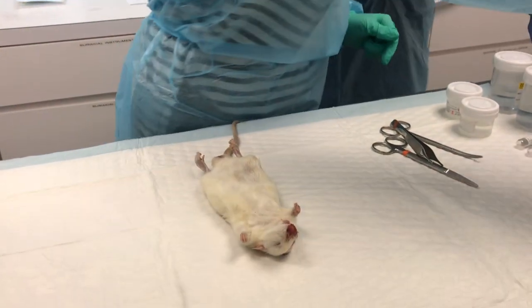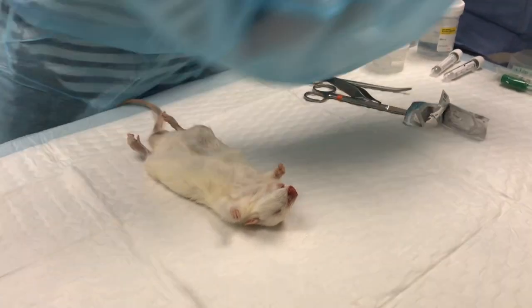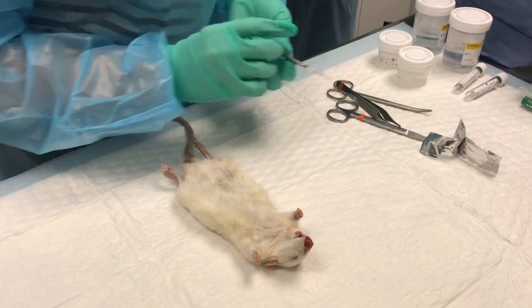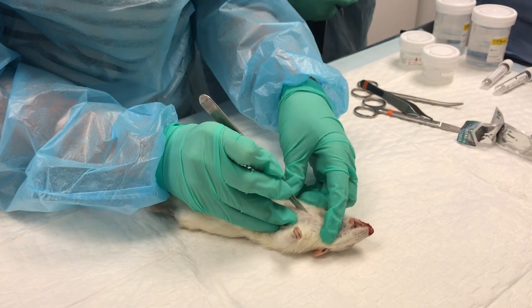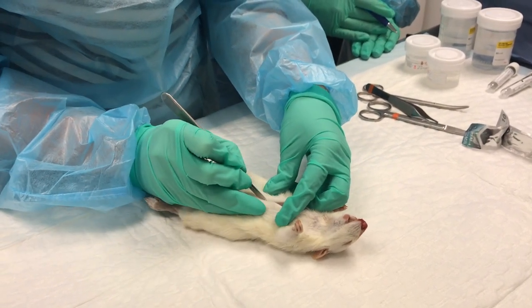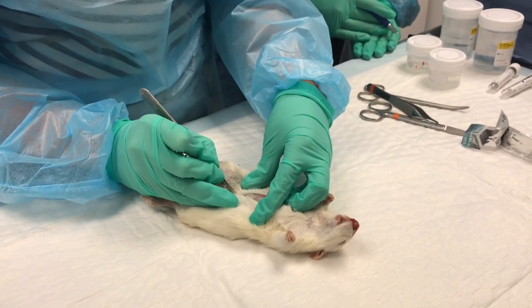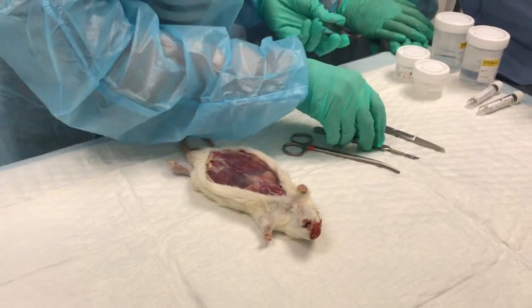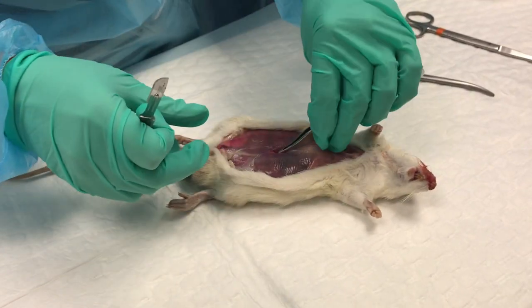So I'm going to open up the belly. Alright, so I normally start all the way up here, and you're just making a midline incision all the way. You have to try not to cut all the way through the abdomen. When you're opening up the abdomen, normally what I do is I pick up right on the linea alba, like that, and then you make a stab incision, straight in, and up, so you don't damage anything.